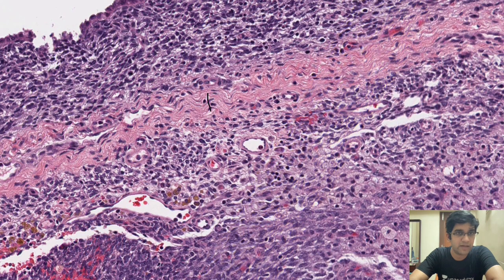What I see here is the same as my first image. I have lots of collagen, must be the normal stroma of the pleura. The lining has been broken here, and it's almost the same image as well. I do see the spindle architecture in the lower half of this field.